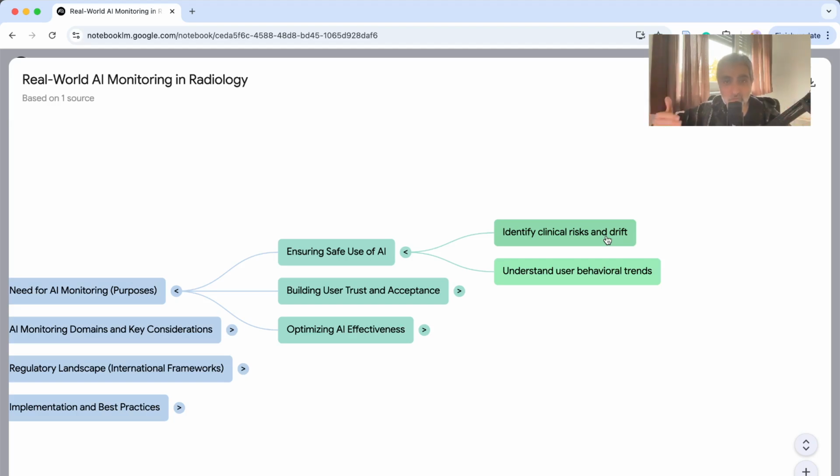So sometimes the models fail to generalize to new data, or it could start performing well in your clinic with your own data, but then as time passes there is a model decay because of new data or subtle changes in the input, or the clinical flow, or the codes you're using, or the documentation, for whatever reason, and you end up with a drift.